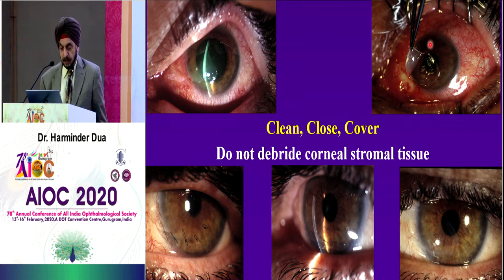Then you lift it up, and this patient was actually referred 2 days after the injury with 3 or 4 lashes in the wound. That's a no-no. You have to clean it. You can tell from the edema how long this wound has been there. It's already become hazy. And then you clean it and you put it back into place and stroke it into place. And because this is a swollen wound and not a LASIK flap, it will not stay by itself.